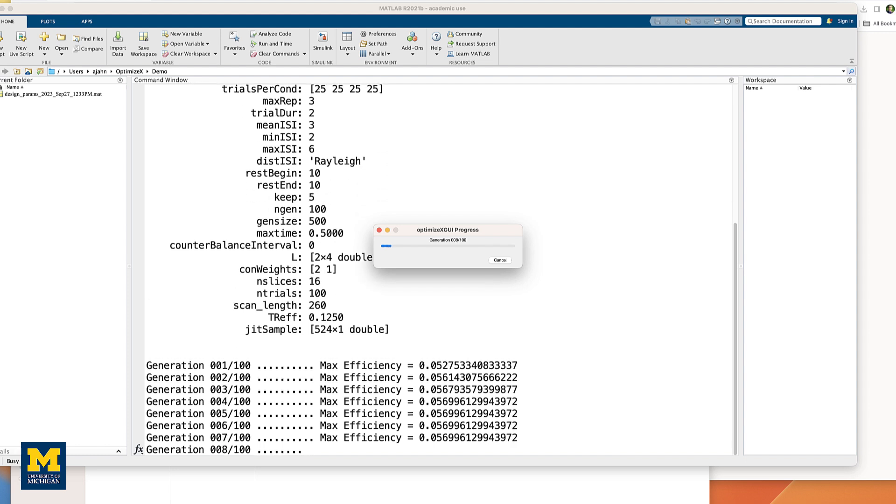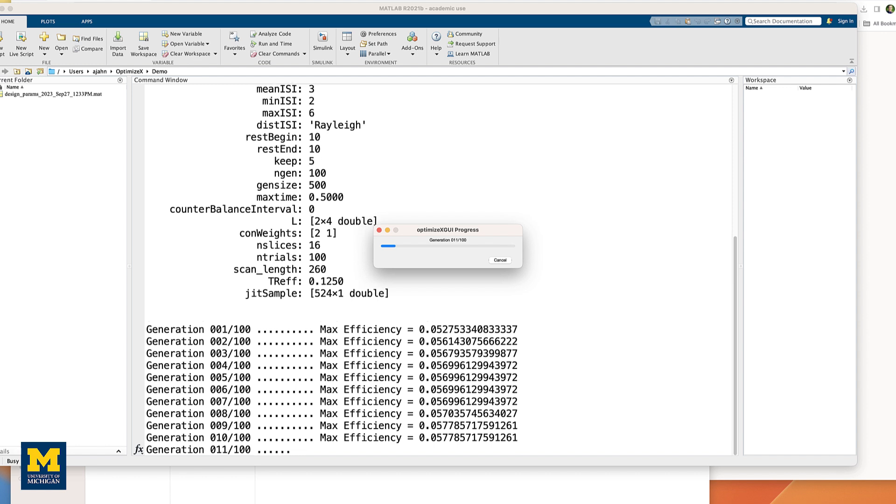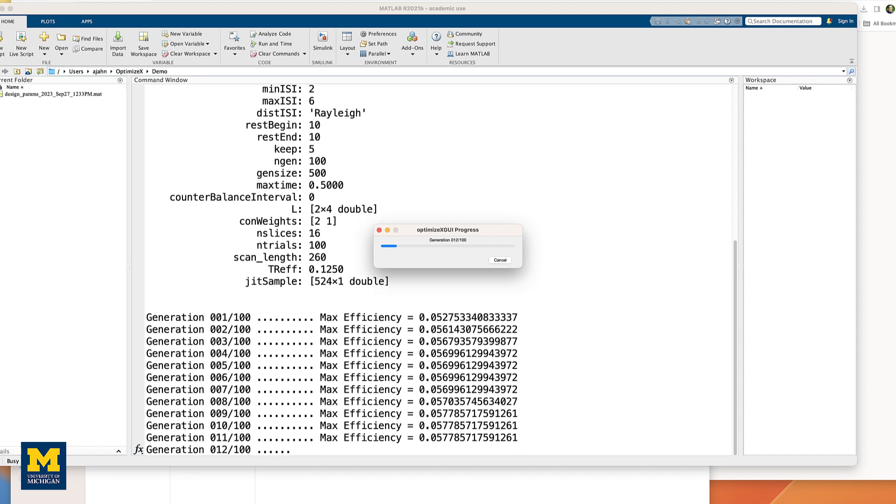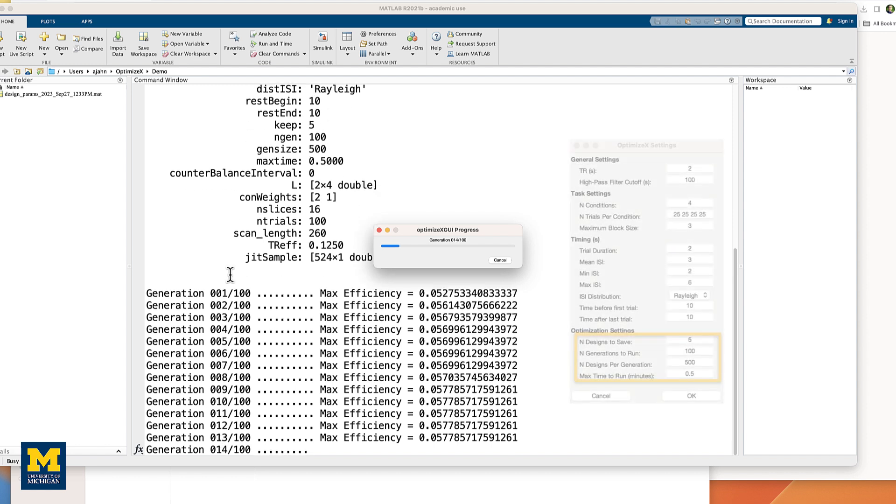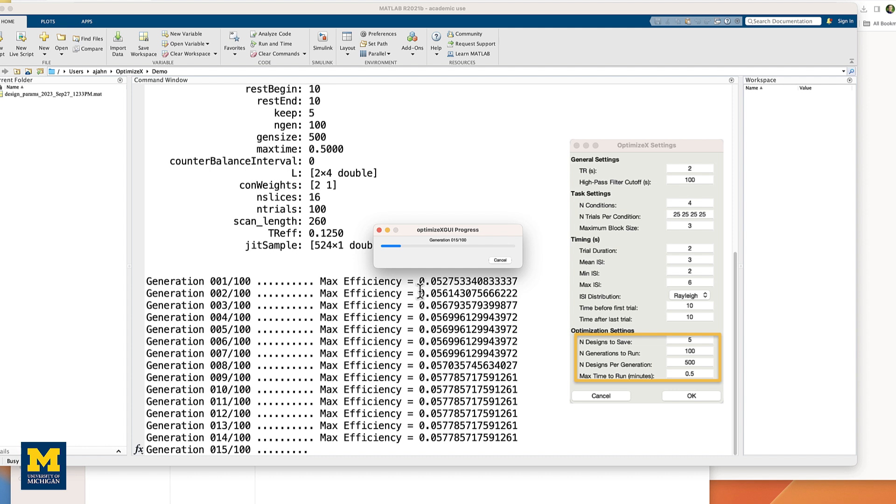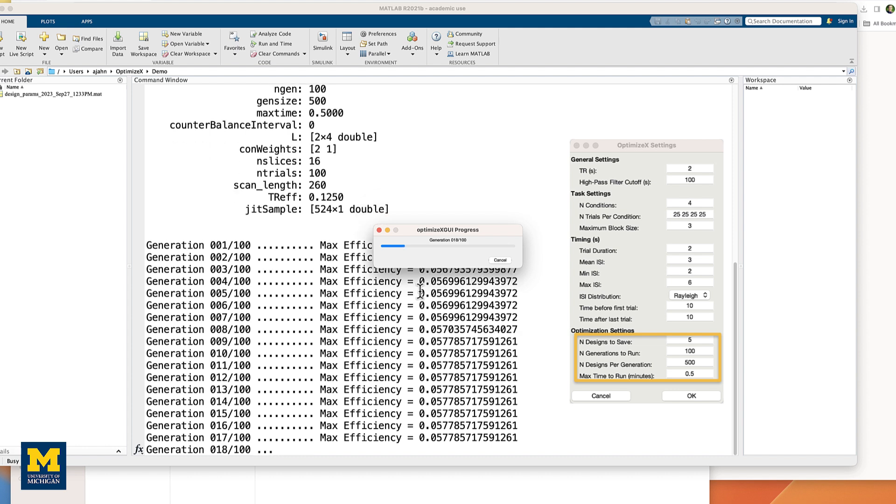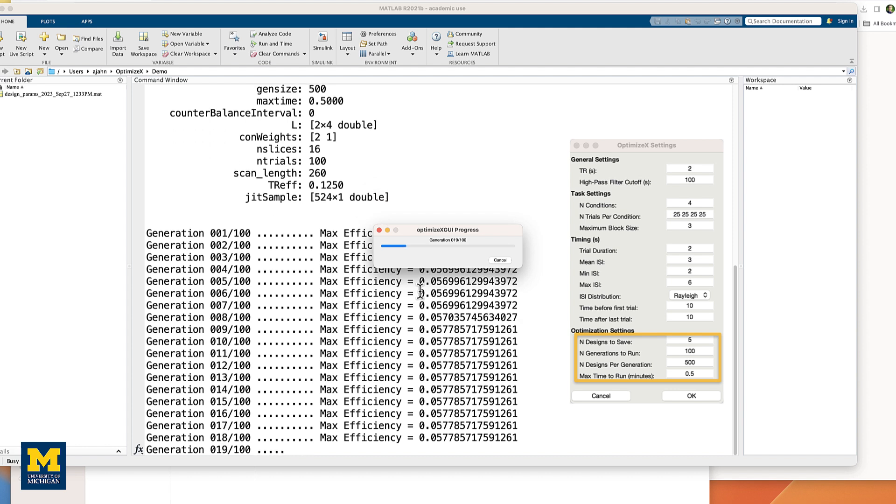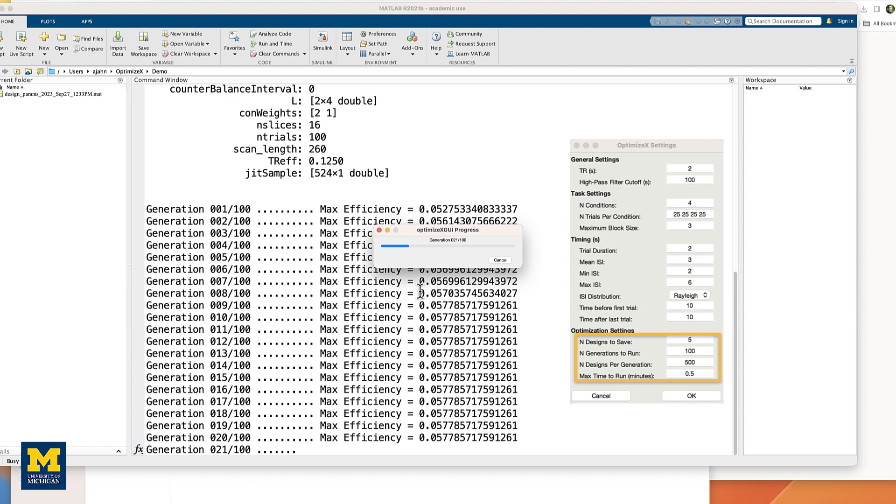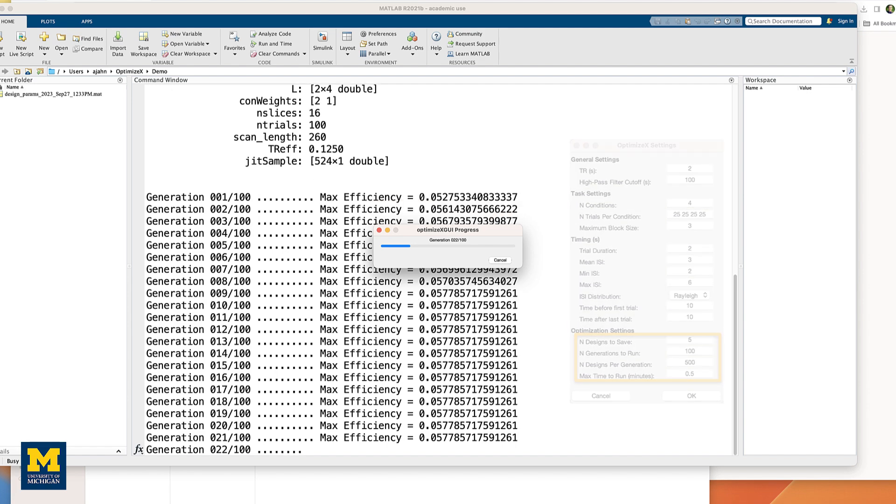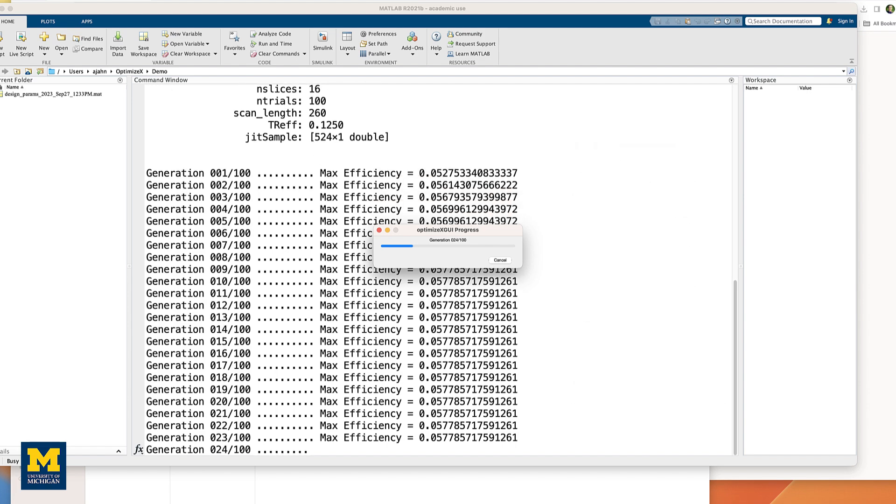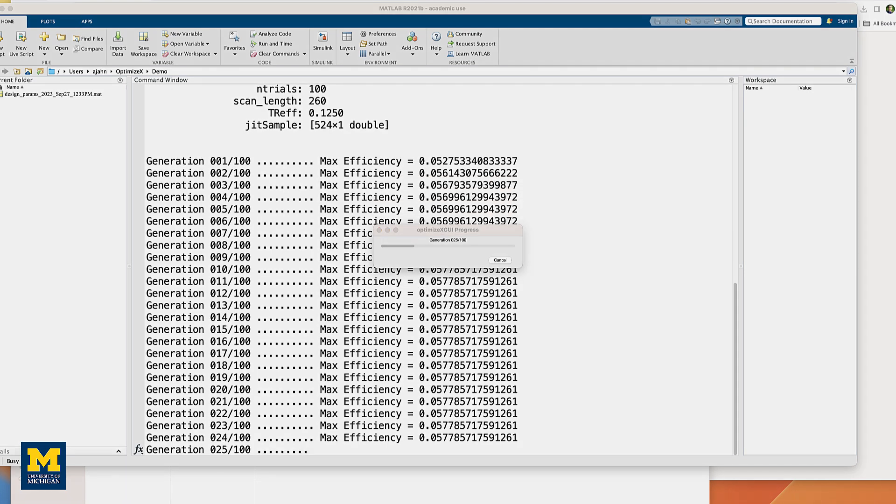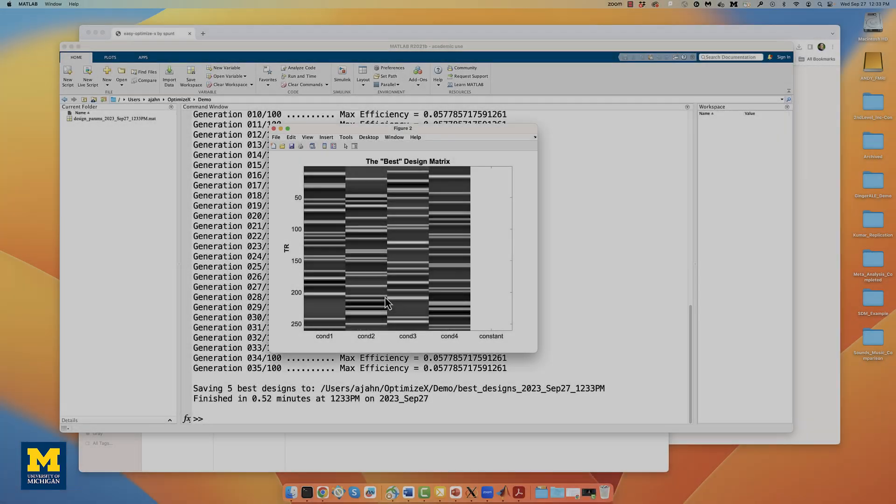If you click OK, OptimizeX will begin simulating many designs, as many as you specified earlier, or as many as it is able to get done within the time limit that you entered. We're going to fade out and come back when it has finished. When it has completed, you will see a figure depicting the best design matrix, according to OptimizeX.